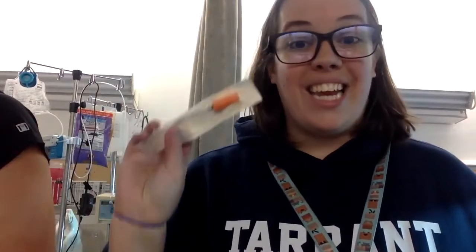Like, what do I need? First, I need to get my supplies. So I need a sub-Q sized needle. And when I say sub-Q sized needle, when I'm trying to go into the subcutaneous tissue, I'm trying to go in just a little bit. I'm not trying to go deep into the muscle. I'm just trying to get into the little bit of the fat. So usually you're going to see that these needles have a very short little needle that's going just a little bit into the tissue. So you can always look at the size of that needle to see if it's appropriate. For example, this is an insulin syringe, and they usually have a special color.